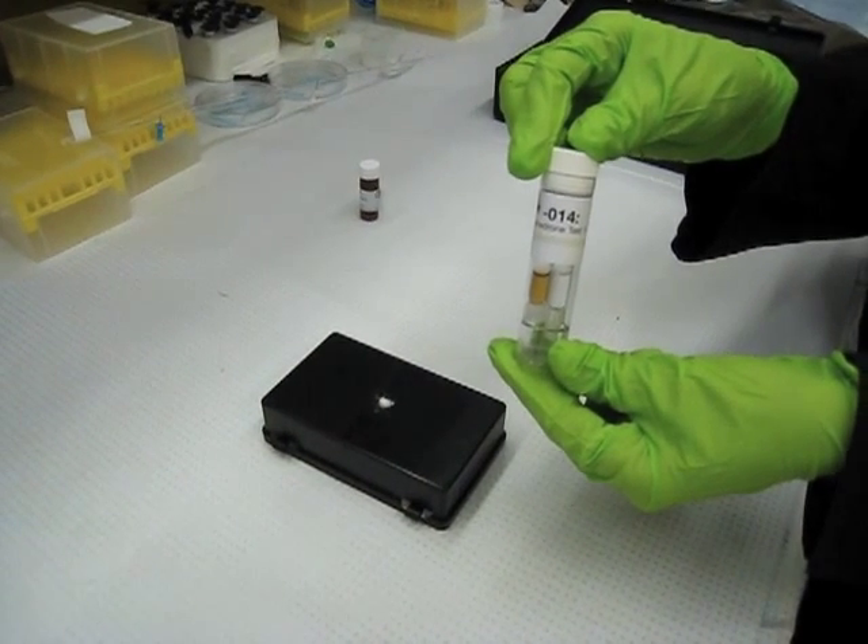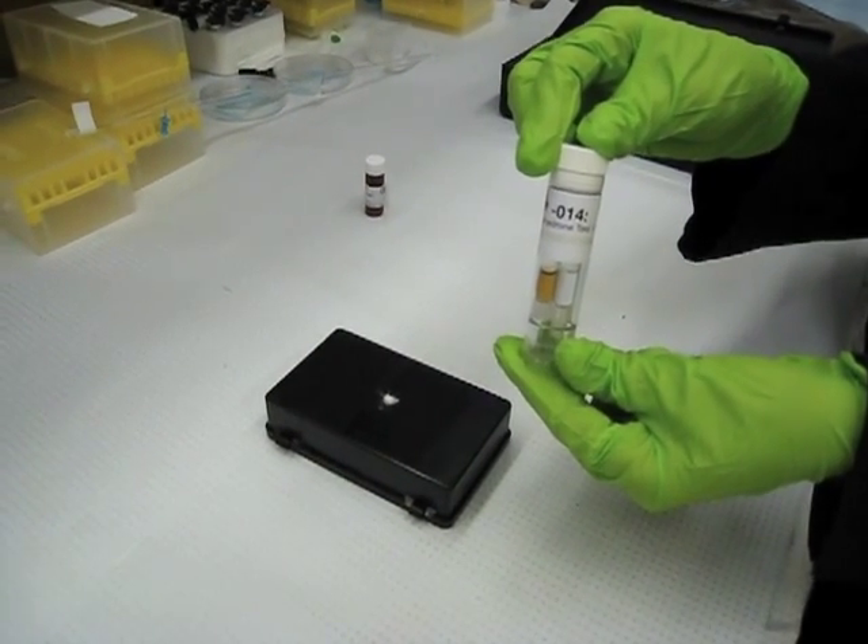This is Dabit 014 Mephedrone Test. This is test one of three.